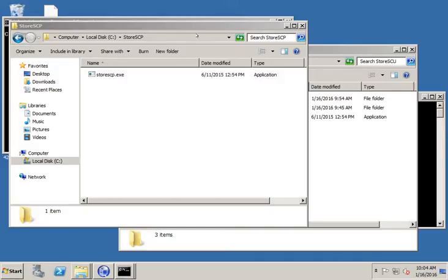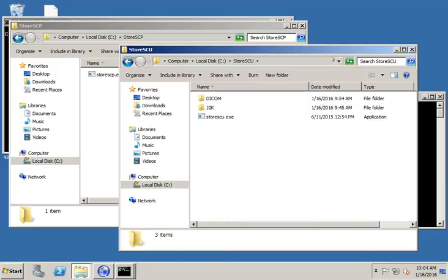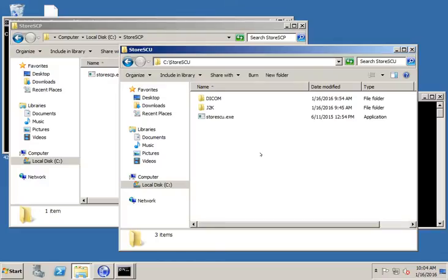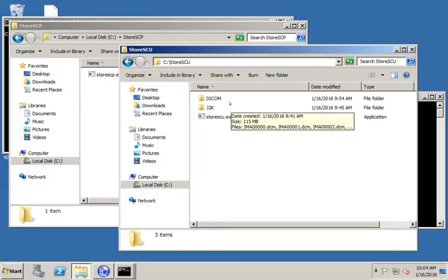The two tools that I'm going to show you are StoreSCP and StoreSCU, and they're both available at dicom.offis.de. So these are both open source tools. They're free. You can download them. They're part of the toolkit.